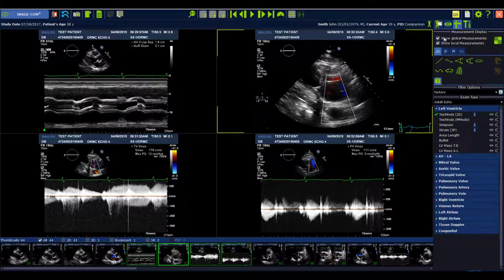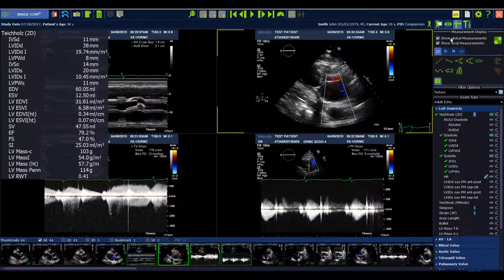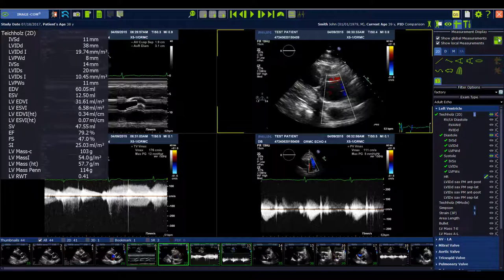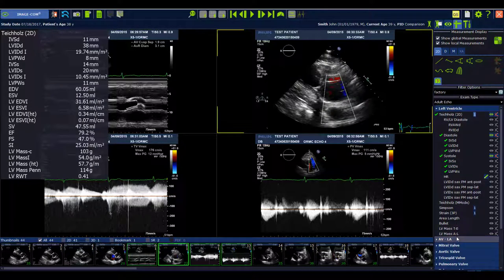Another change in TOMTEC Arena 230 is the measurements overlay selection. Here you can decide if you want to see the global measurements and local measurements or not. You can switch off the global measurements or switch them on, and even change the position — deciding if you want the measurements on the left side or on the right side.